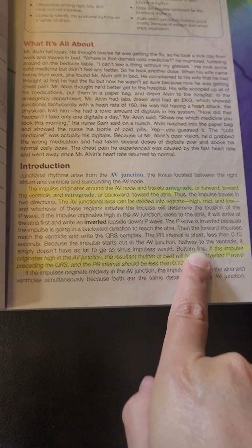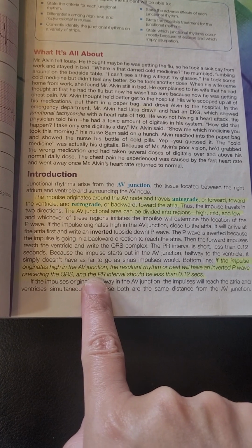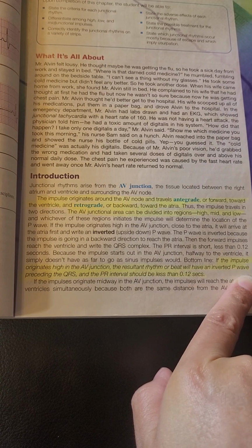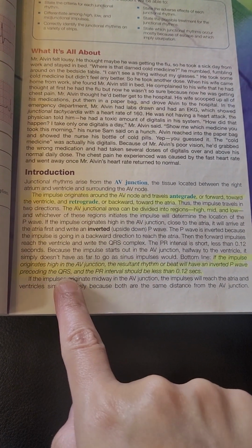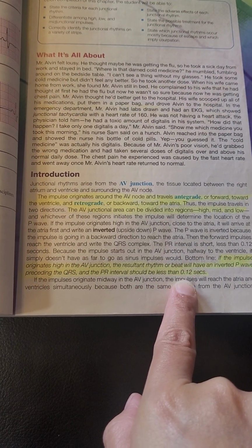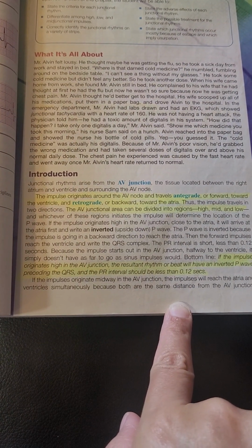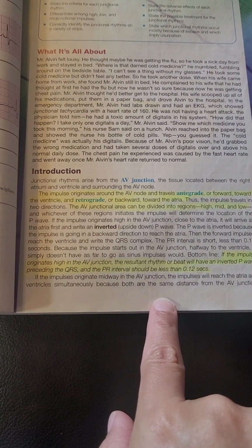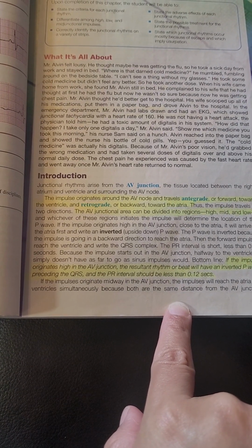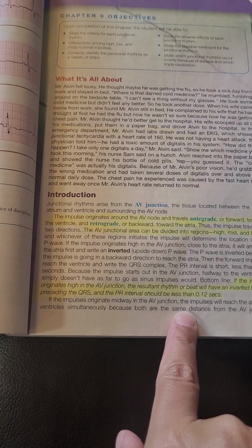Bottom line: if the impulse originates high in the AV junction, the resultant rhythm or beat will have an inverted P wave preceding the QRS, and the PR interval should be less than 0.12 seconds. So the P wave is going to be closer to the QRS. That's how you know when it's too close and you have an inverted P wave, then that's when you know you have a junctional rhythm.